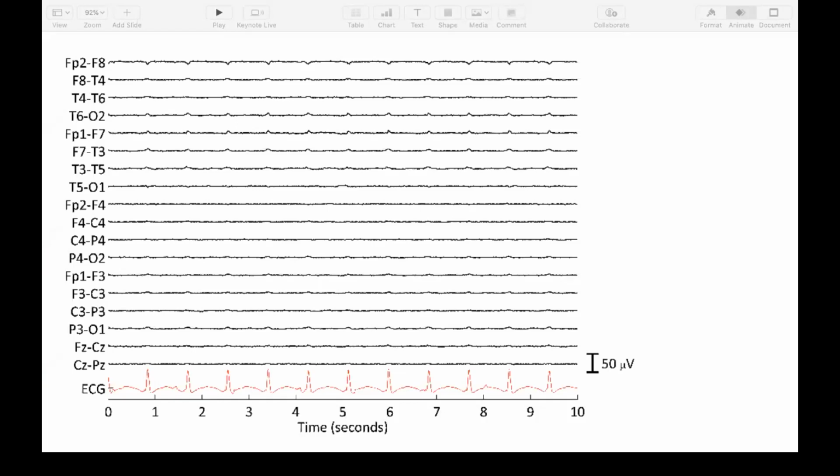So what can we observe in these patients? Well, it's good to realize that in essence, in all these patients, immediately after arrest, the EEG is flat, as was illustrated by the patient who went to our department for either syncopes or seizures, because already after 1 minute of cessation of heart function, we observe a loss of synaptic transmission such that the EEG doesn't show any electrical activity.